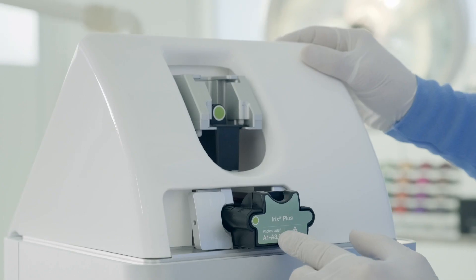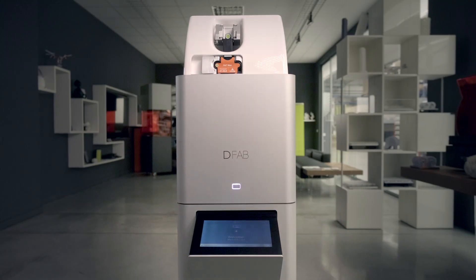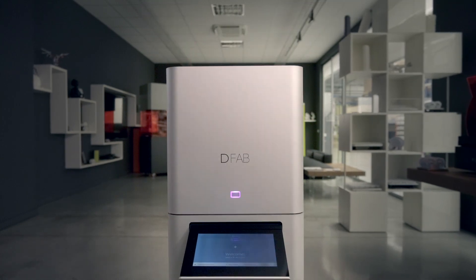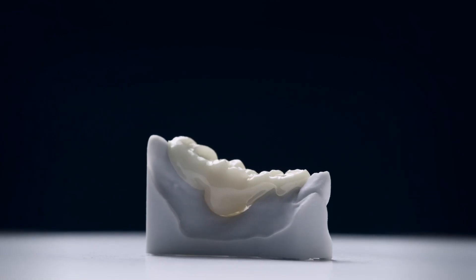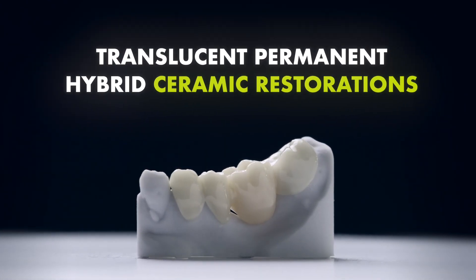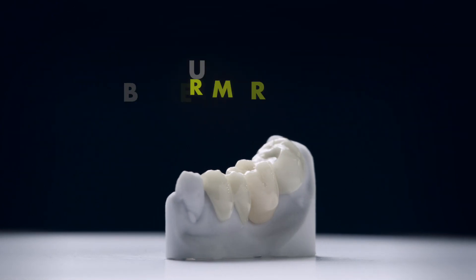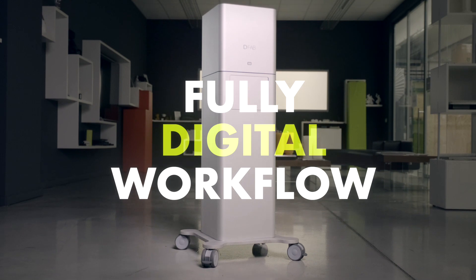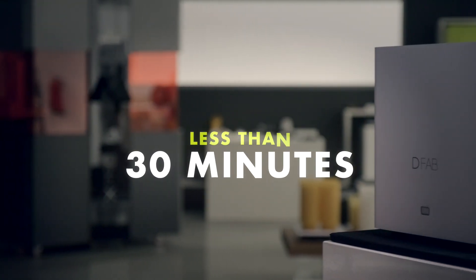DFAB, the turning point of the dentistry world, is the result of the long-term experience of DWS at work to meet these needs. With the DFAB system, it is possible to create translucent final hybrid ceramic restorations of up to 10 units with the utmost precision, thanks to a technology that enables a fully digital workflow lasting less than 30 minutes.